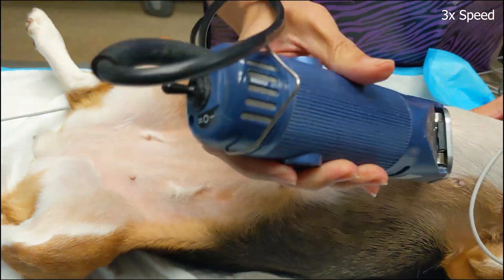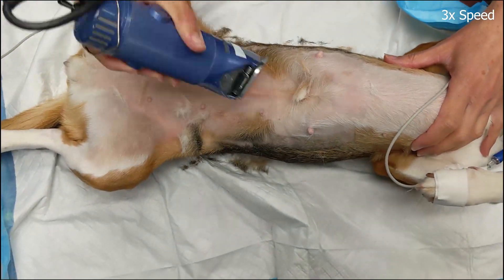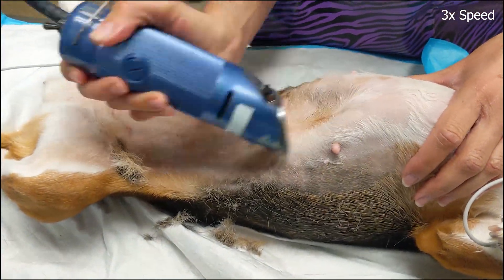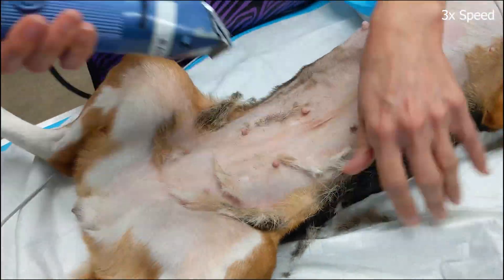Anytime you enter the abdomen for surgery, the entire abdomen should be clipped and prepped in the event of an urgent need to enlarge your abdominal approach. The fur is clipped from the pubis to one centimeter cranial to the xiphoid process, and roughly a clipper blade's width lateral to the teats on either side.